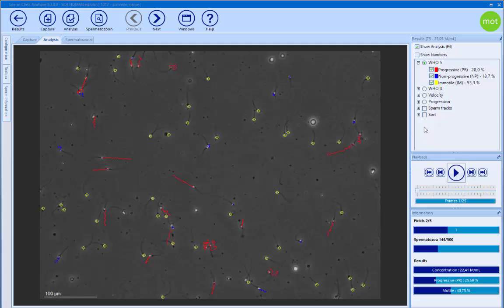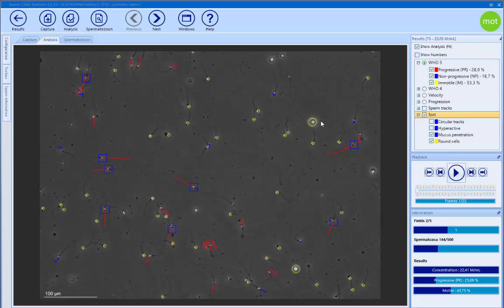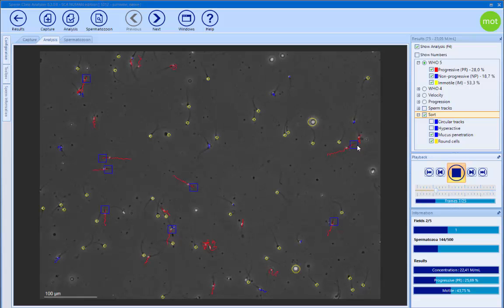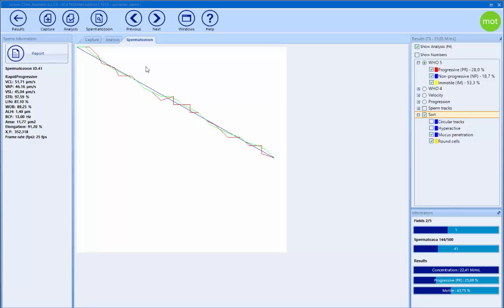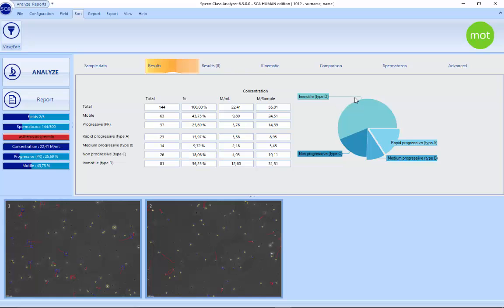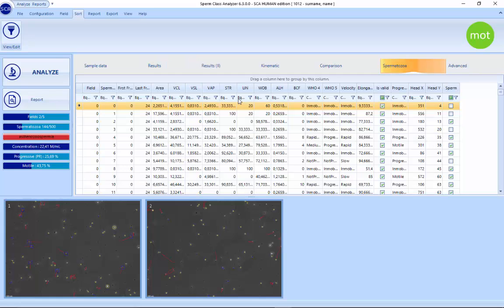Also in version 6.3, it's easy to see the overlay sources on the same image. If I press play, we have the sperm that can penetrate the mucus shown in blue squares, and the round cells shown in yellow. If I go to one of these sperms and double-click, I can see the track with all its characteristics. From the spermatozoa view, I have all sperms listed one by one, and pressing 'Report' exports everything directly to Excel — it's very easy to export the characteristics of each sperm.